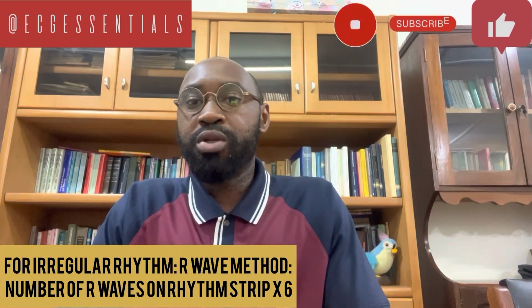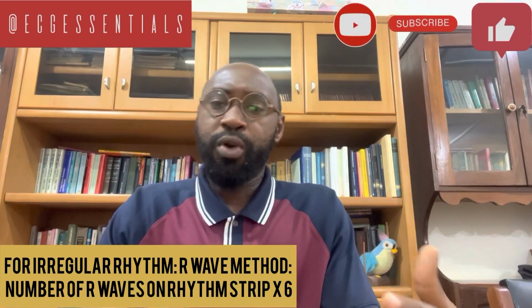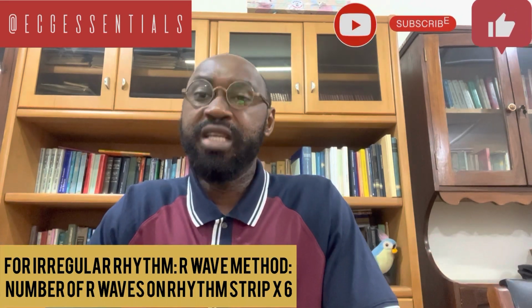This is so because the rhythm strip, which is mostly lead 2, usually records for a longer period as opposed to the other leads.